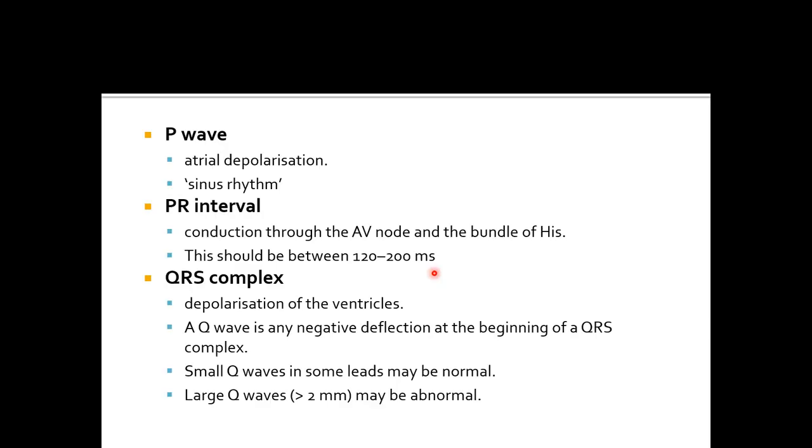So ECG consists of waves. As you have already read in Guyton, what these waves stand for: P, Q, R, S, T. These are the waves. Sometimes there is an additional wave called the U wave. The P wave basically arises because of atrial depolarization. The PR interval depicts the time taken for the electrical conduction from the SA node to the AV node.